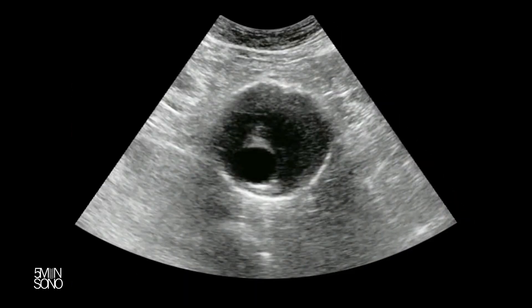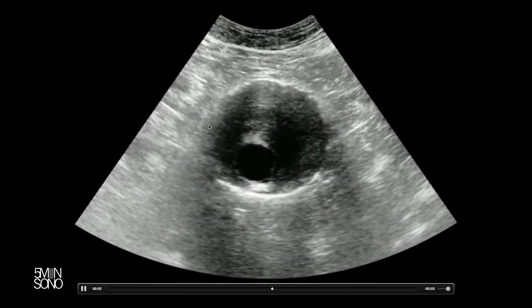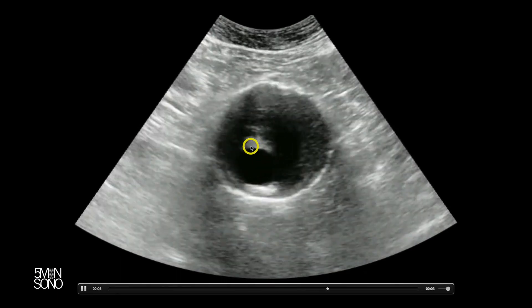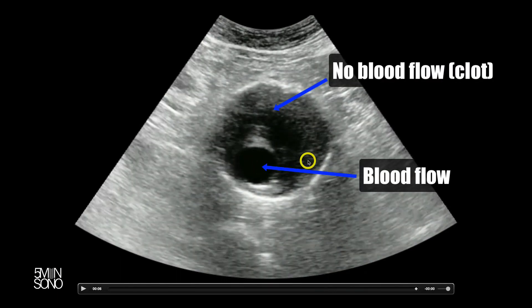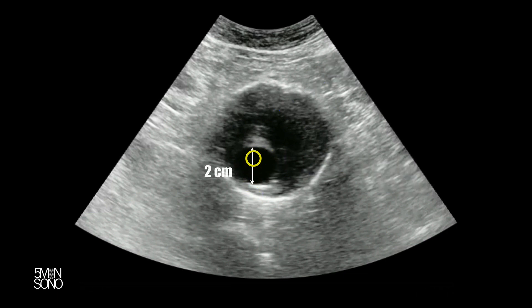There's one aorta here and it splits into two iliacs right there. So this is an aortic aneurysm — a pretty big one. Now, this area right here has flow in it, but all of this is clot. You can't just measure the flow channel; if you did, you'd say it's two centimeters — not a big deal, less than three centimeters. But in fact, you have to measure outer wall to outer wall. You can see that this is actually a very big seven centimeter aneurysm.